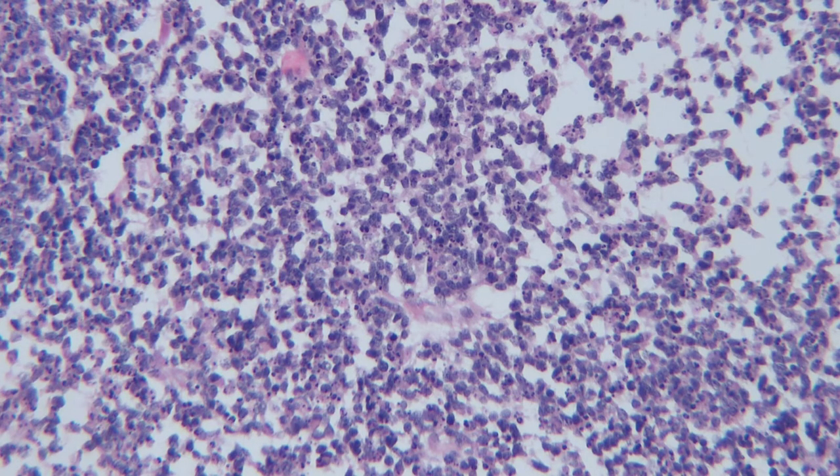So we'll start first with the primitive small blue cell population, and we'll call that blastema. But again, it's an embryonal or primitive appearance to the tumor cells. Most notably, they have larger nuclei, very little cytoplasm, which gives it that blue appearance from low magnification.